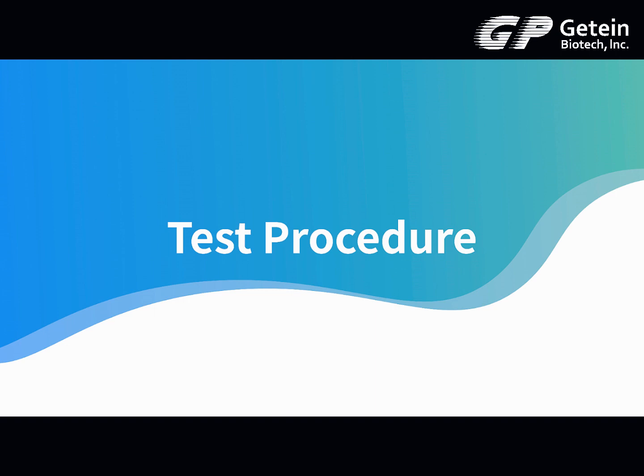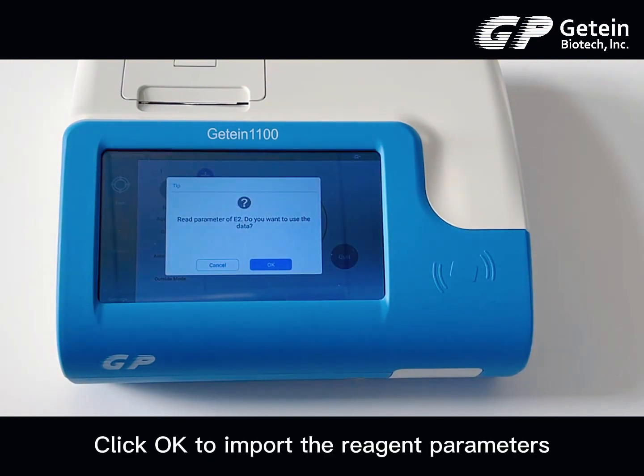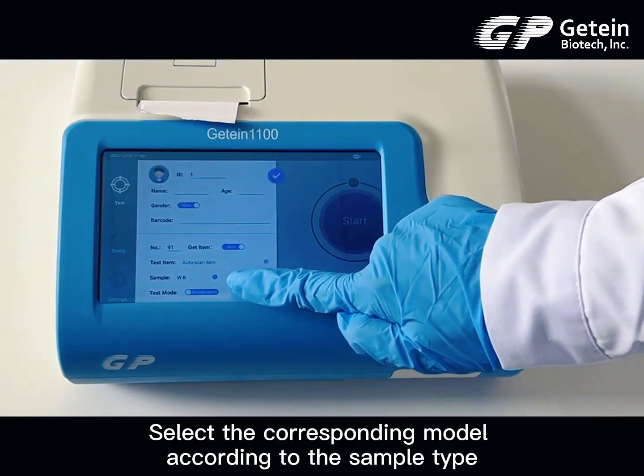Test Procedure. Attach the SD card to the SD card recognition zone. Click OK to import the reagent parameters. Select the corresponding model according to the sample type.